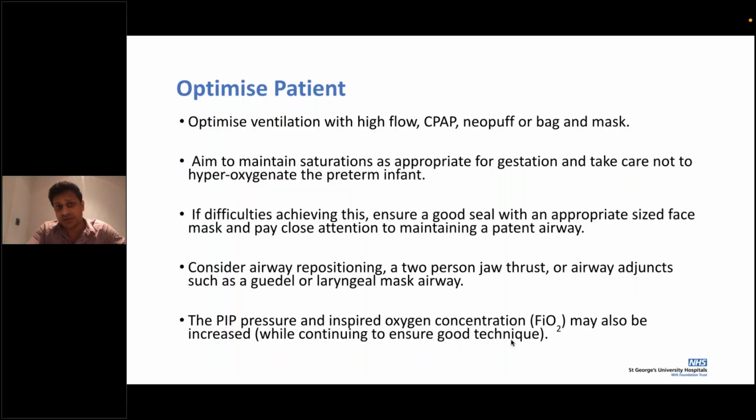So how do we plan this? Once the decision is made, optimize. The baby would already have some kind of non-invasive support on the neonatal unit. Let that continue until you've given your medication. Then take over, put it back on mask, and ensure that the NG tube is in. The bedside nurse would then aspirate the tummy while you're at the baby's head.